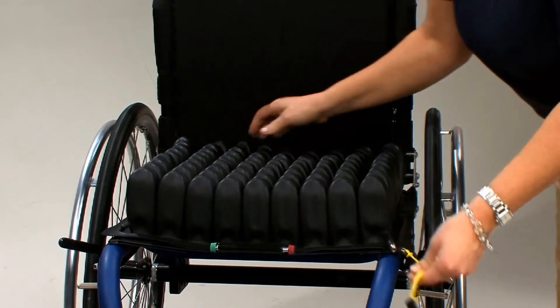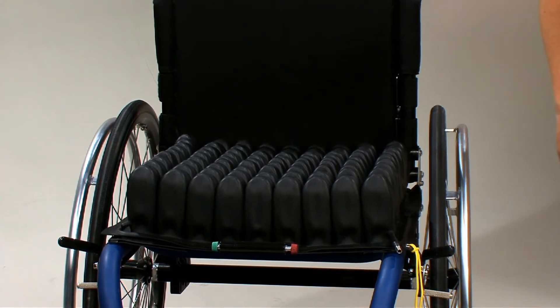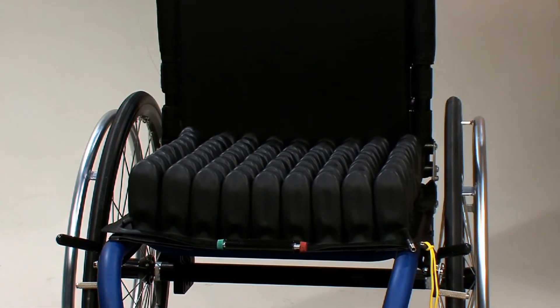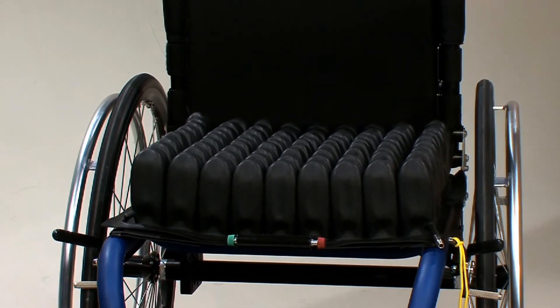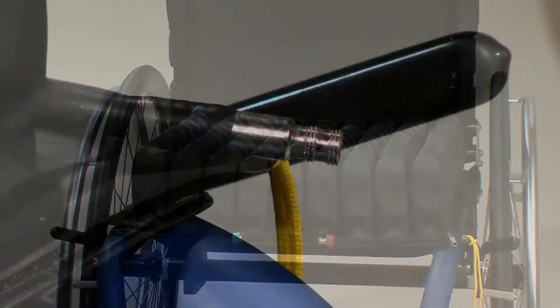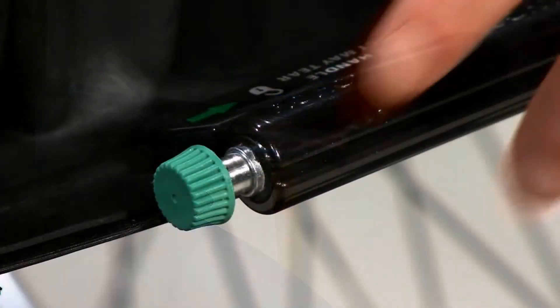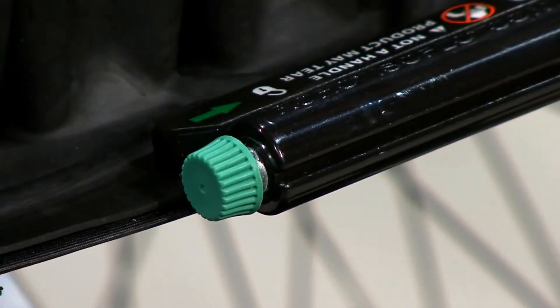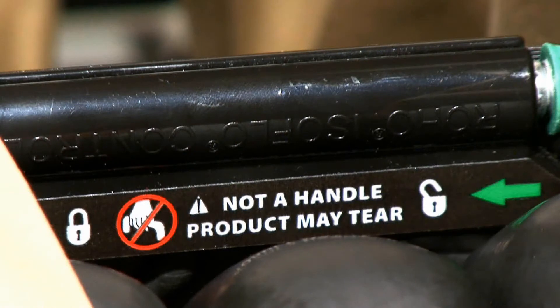First, start by placing the select cushion on the wheelchair, making sure it is centered with air cells up and the Isoflow memory control facing forward. Consult your prescriber about alternate positions of Isoflow. Next, turn the air valve counterclockwise to open. Make sure the Isoflow memory control is also open by pushing the Isoflow's green knob to the right, or unlocked.